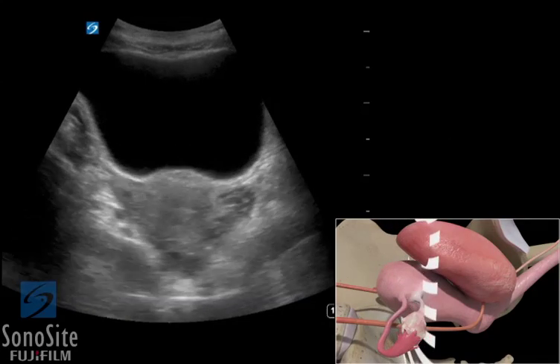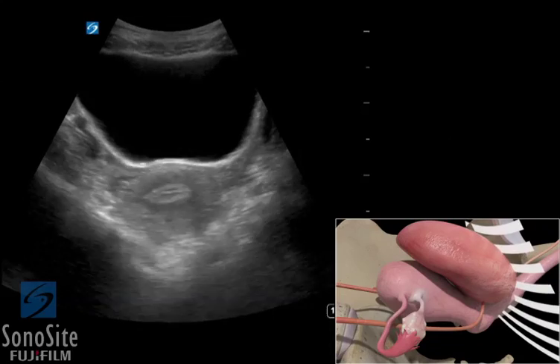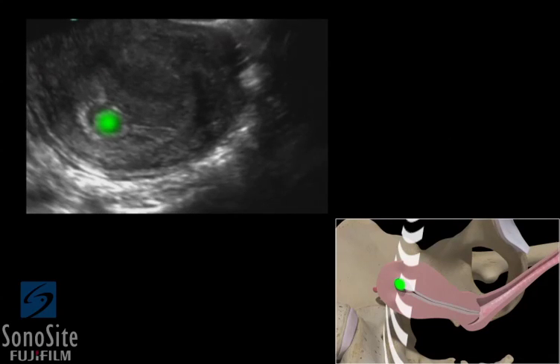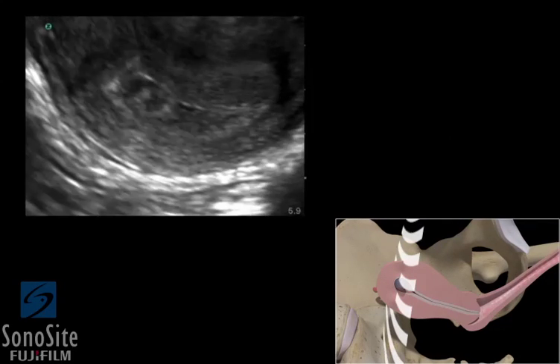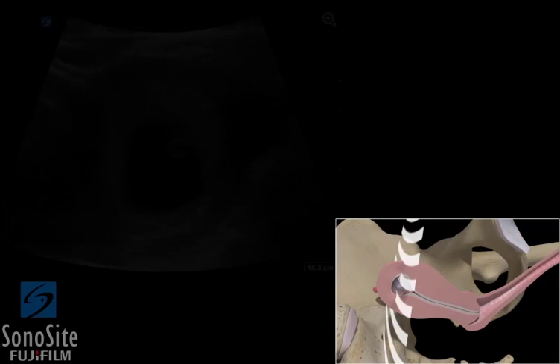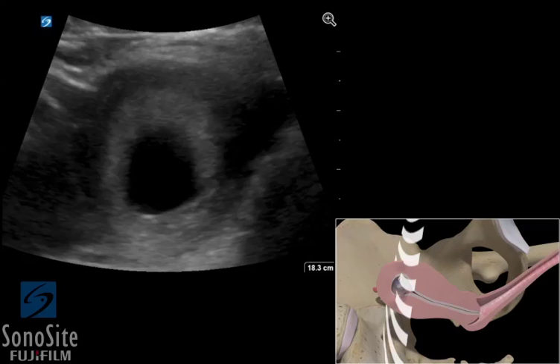In a patient with a suspected ectopic pregnancy, the presence of an intrauterine pregnancy makes the diagnosis unlikely. The earliest sign of pregnancy seen by ultrasound is the gestational sac. However, a decidual cyst or pseudogestational sac, which can be seen in an ectopic pregnancy, may be confused for a gestational sac. Therefore, definitive sonographic evidence of an intrauterine pregnancy should only be established when a gestational sac containing a yolk sac is identified in two planes within the endometrium.